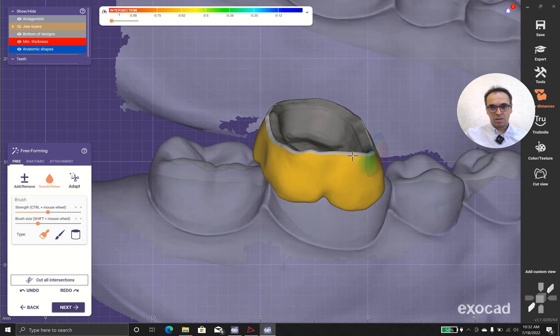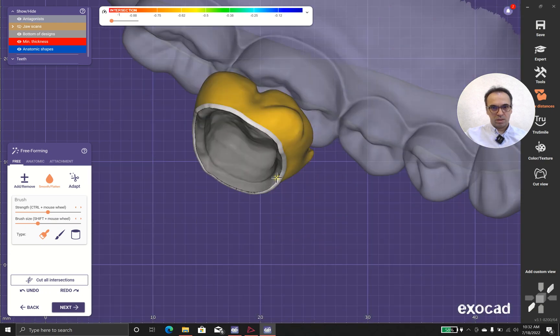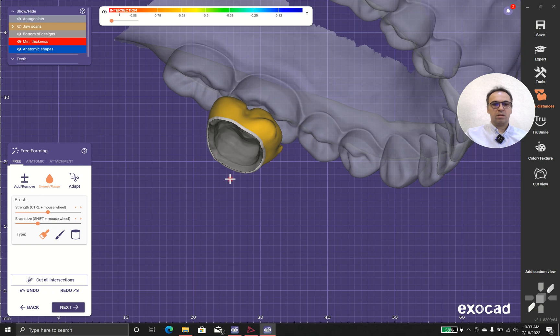And it's better to soften here a little bit because sharp edges is not something that we are going for it. Okay.